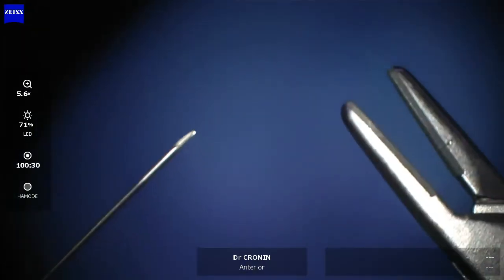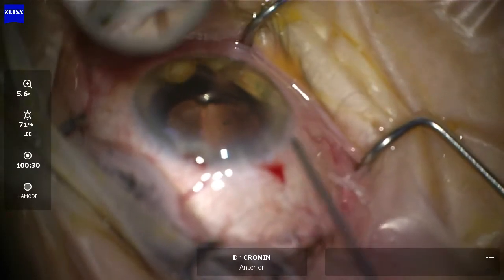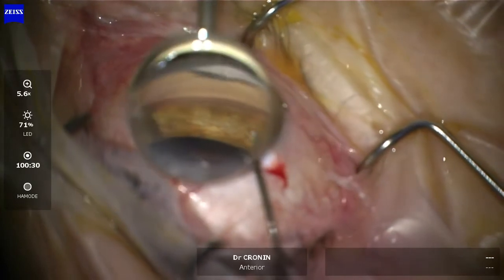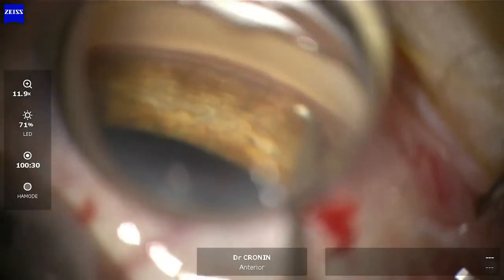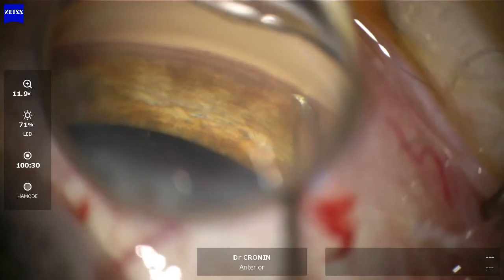You can see I'm bending a 23 gauge needle using a pair of needle holders. Do that delicately. It needs to be bent about 90 degrees. The trick of the surgery here is twofold. Number one, to incise and remove the trabecular meshwork, not just to incise it, you really do want to remove it, but also not to damage the posterior or external wall of the canal of Schlemm.